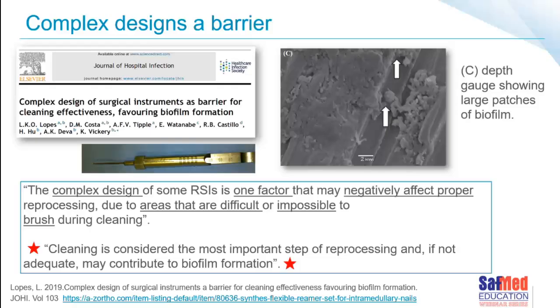And that's why people like Kramer, etc., are writing these papers. That's why ASO is establishing a new guideline to help us understand about the cleaning of these complex devices. Of course, cleaning is considered the most important step of reprocessing. We know that, and if not adequate, it may contribute to biofilm formation.